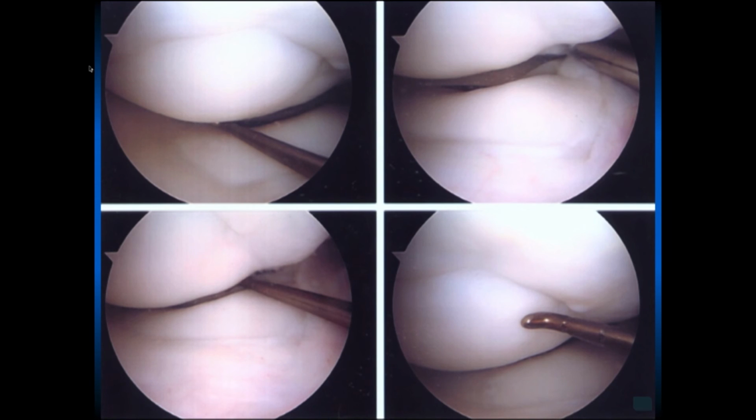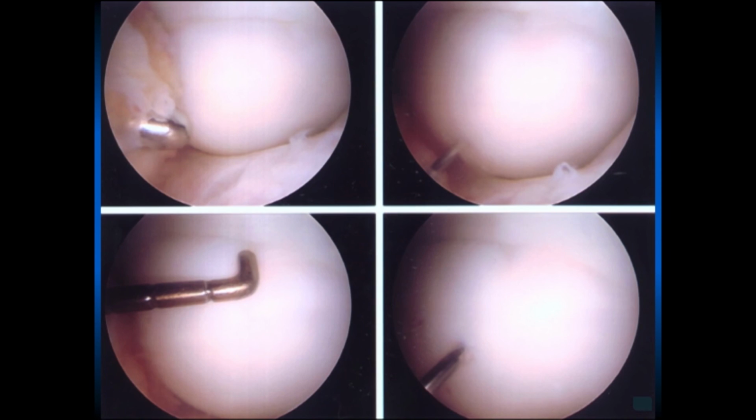Arthroscopically, this is what that lateral femoral condyle OCD lesion looks like. This is the anterior horn of his lateral meniscus, and you can see here kind of like a baby's butt indentation right there. That's where the unstable lesion is. It does look to be intact, so to get this to heal more favorably, we can do a drilling with a smooth K-wire this way or with a jig going the other way. One of the problems with it going this way is that that piece can be displaced. And this is doing the antegrade drilling of this to get better blood supply. This was stable.